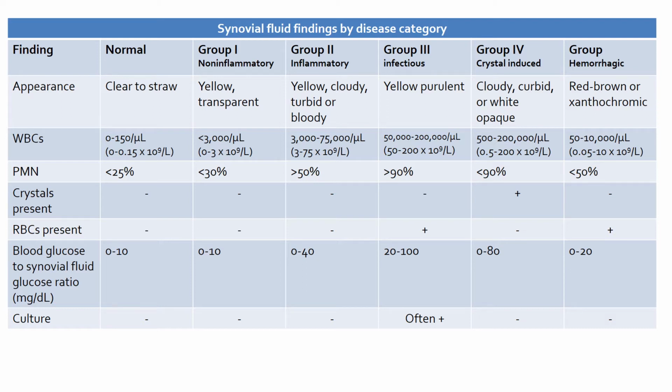And one of those would be occasionally we see something called an ochronotic fluid, which is a fluid that has these dark speckled particles in it. It's called the ground pepper sign. So it really does look like you have ground pepper in the fluid. And what this is, the patient has developed a buildup of homogentisic acid in the tissues, which includes the fluids, and that will come out as these little dark colored flake looking precipitate in the fluid.